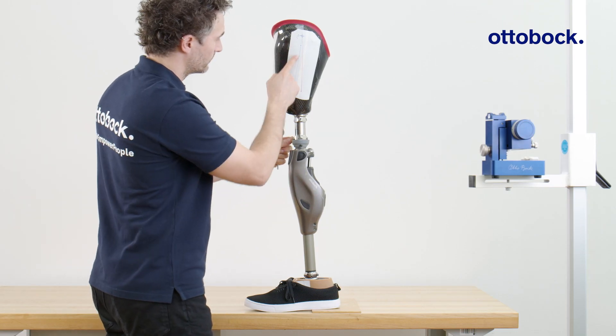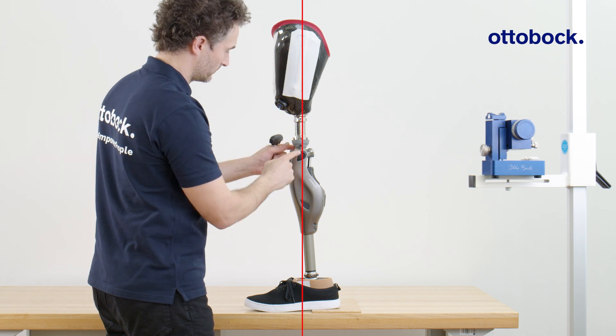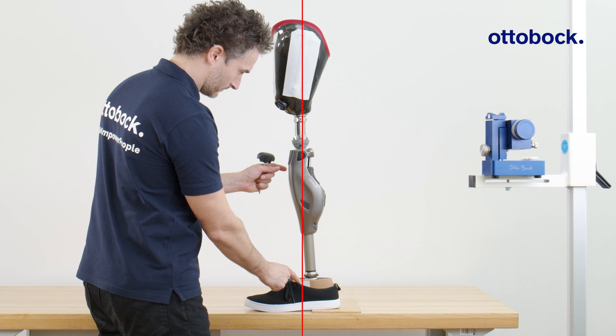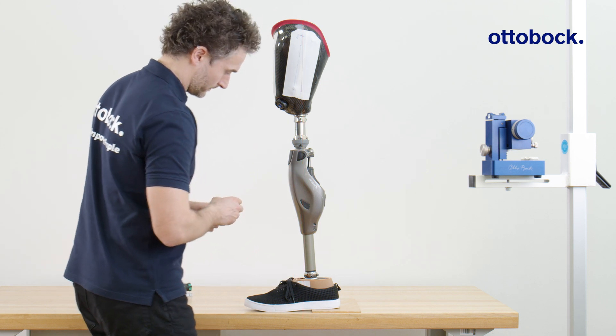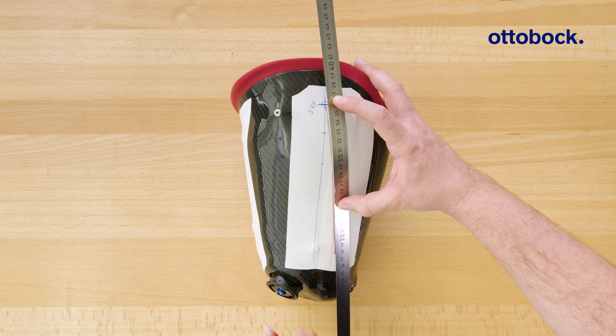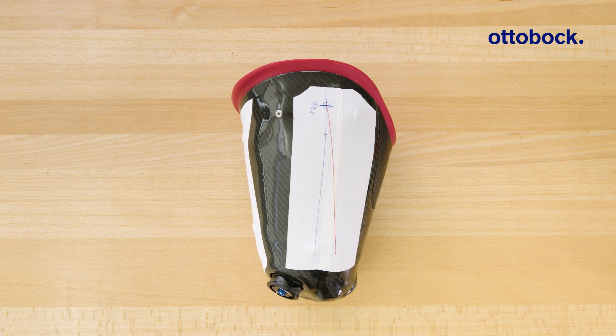In this tutorial, you will learn how to bench align a microprocessor-controlled knee joint using the Kinect GoPro app and a plumb line or laser line. You will furthermore learn how to define the reference lines on both the socket and the foot.